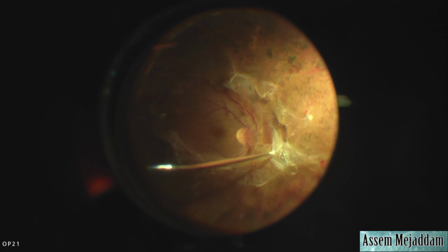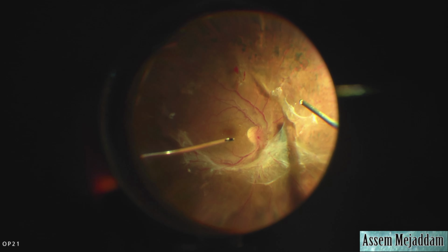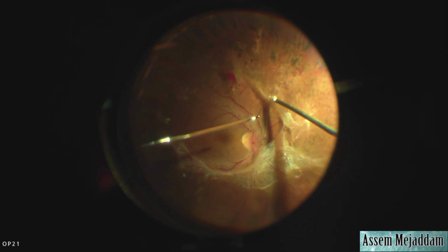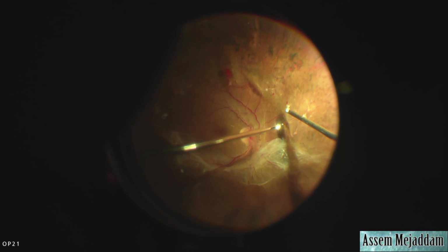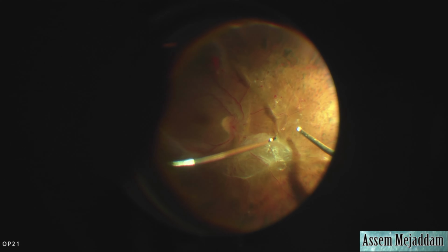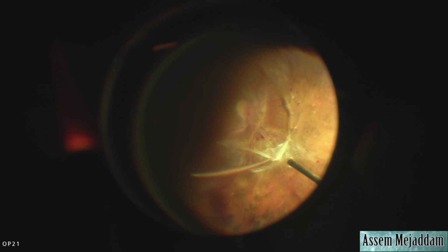I've started out with doing a peripheral vitrectomy in order to start the dissection. Thereafter I've used a pick in order to induce a PVD from the posterior pole, from the disc. This is a very good maneuver in case one wants to start from the in and out maneuver.